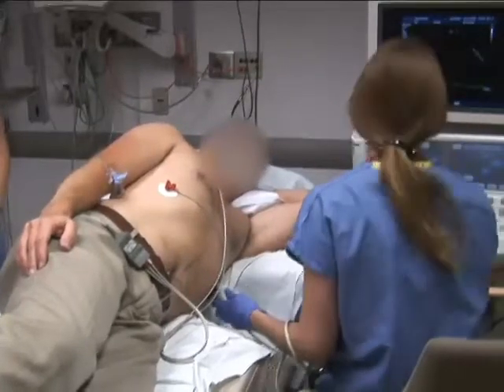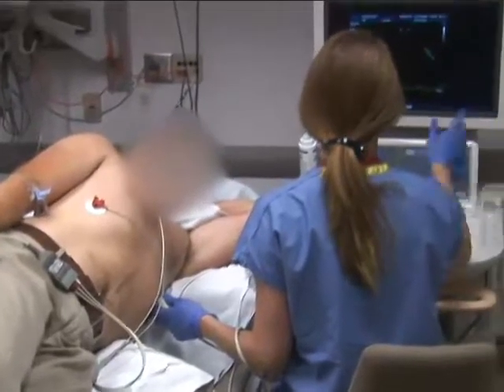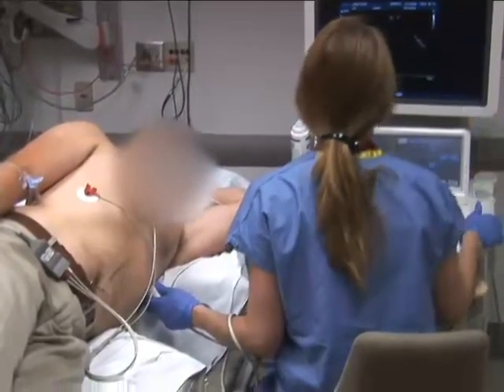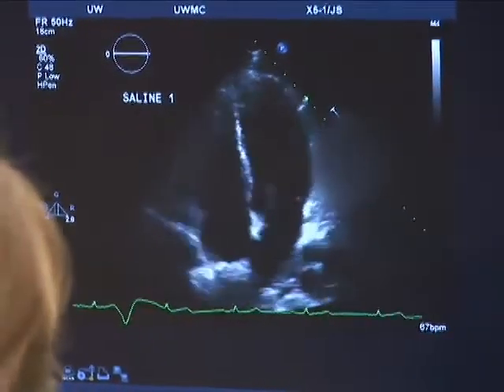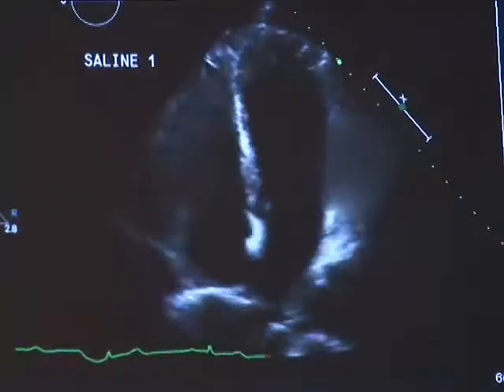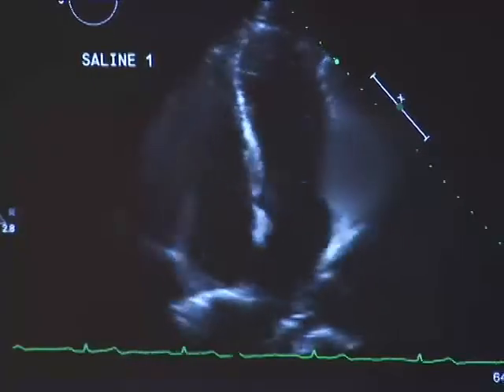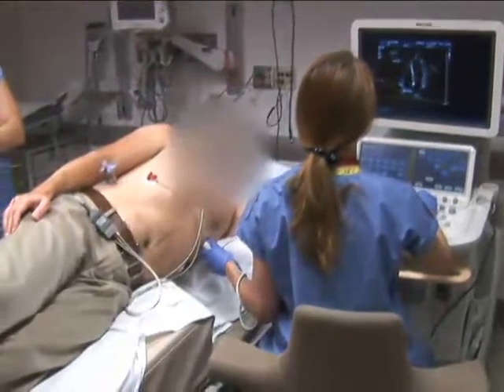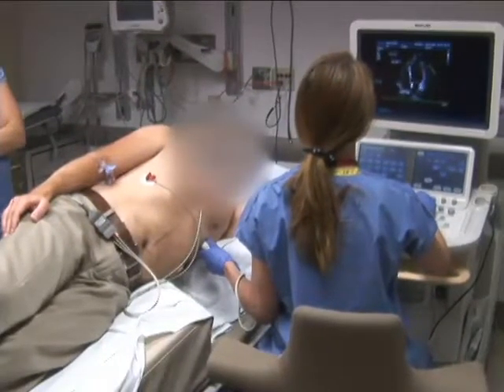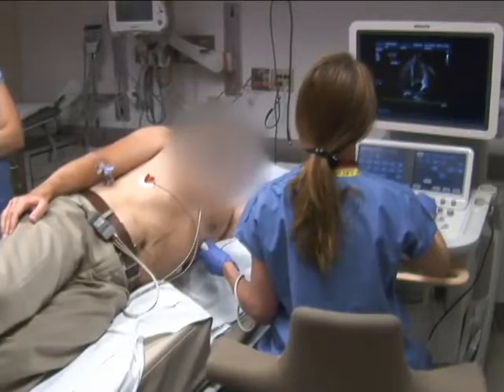The ECG monitoring electrodes are applied by the sonographer, and the patient is placed in the left lateral decubitus position for echocardiographic imaging. Baseline images are obtained, and a view is chosen that shows the interatrial septum and the right and left atrium to allow visualization and timing of the appearance of contrast in the left heart. On transthoracic imaging, an apical 4-chamber view often is used. A subcostal view may be used if an apical view is not obtainable.